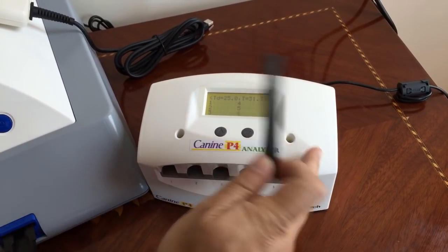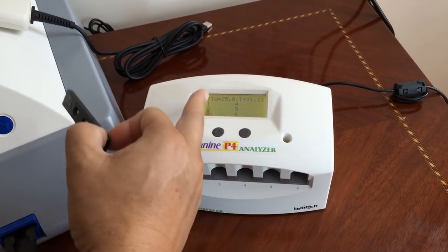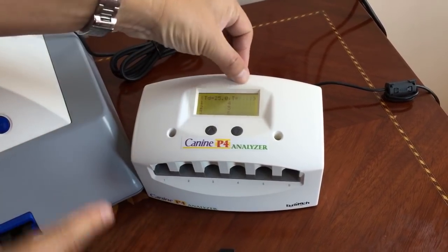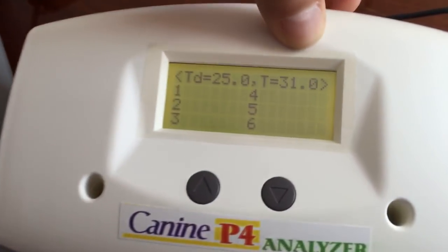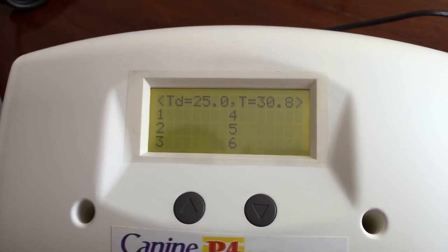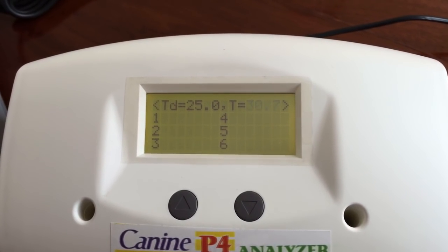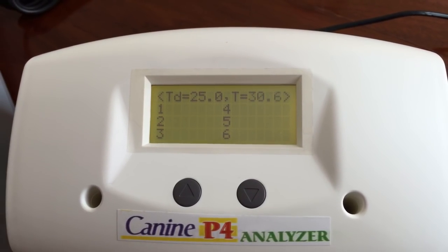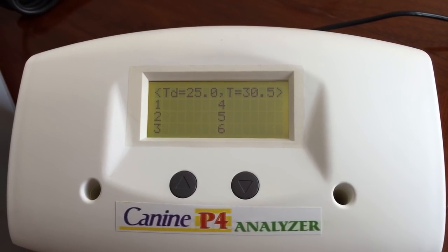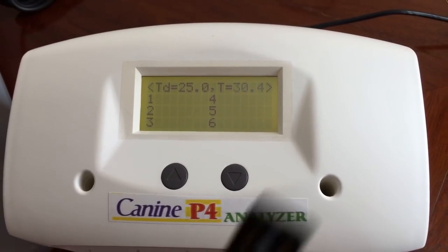You have to turn on this machine 10 minutes before you start setting up the test, because it needs to be at 25 Celsius. Right now it's at 31 Celsius and it gradually comes down until it reaches 25 Celsius. As soon as it reaches 25 Celsius, the fans turn off, it stabilizes, and it stays at 25 Celsius — so when you incubate, you're incubating at a perfect temperature.